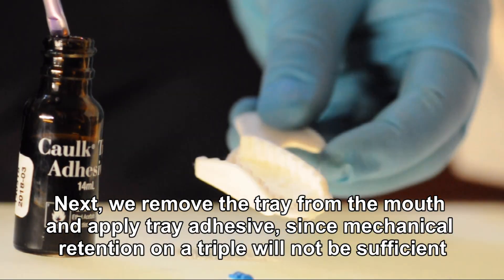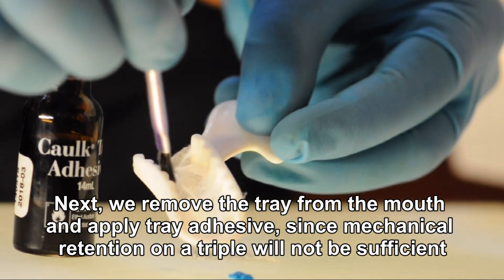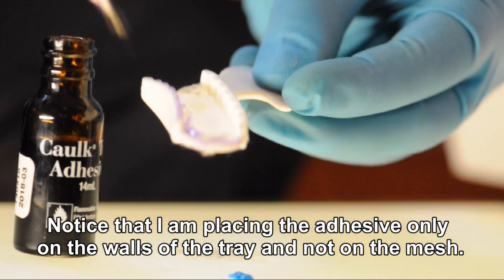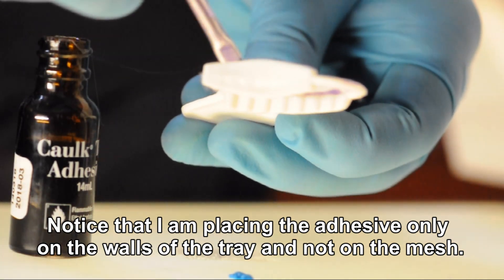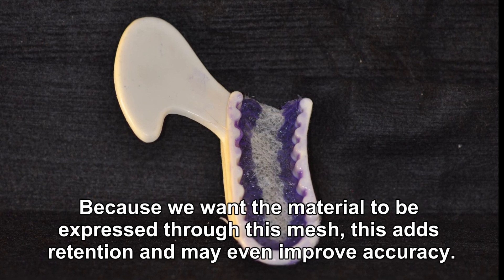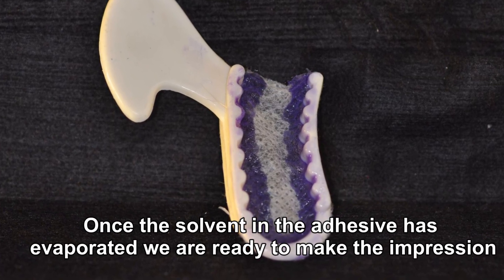Next, remove the tray from the mouth and apply tray adhesive, since mechanical retention on a triple tray will not be sufficient. Notice that the adhesive is placed only on the walls of the tray and not on the mesh, because we want the material to be expressed through the mesh. This adds retention and may even improve accuracy. Once the solvent in the adhesive has evaporated, we are ready to make the impression.